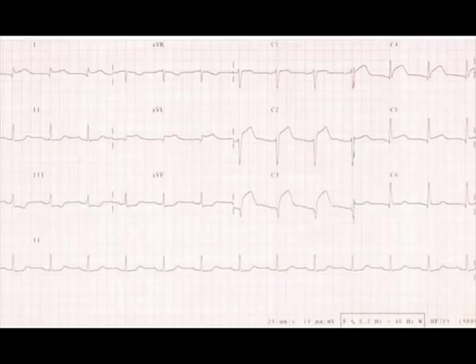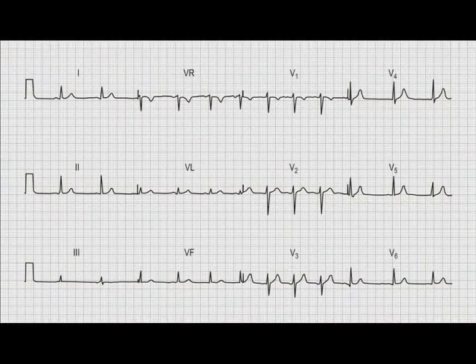You get a nice tall R wave. Therefore, if the patient is in sinus rhythm, it will appear more familiar to you because it will match more of what you see in a textbook. If you're uncertain whether they're in sinus rhythm, look at a few more leads. If you're absolutely clear they're not in sinus rhythm, you've got to work out what the arrhythmia is based on your ECG knowledge and the presenting patient in front of you. It's beyond the scope of this clip to go through every possible arrhythmia, so do keep practising.